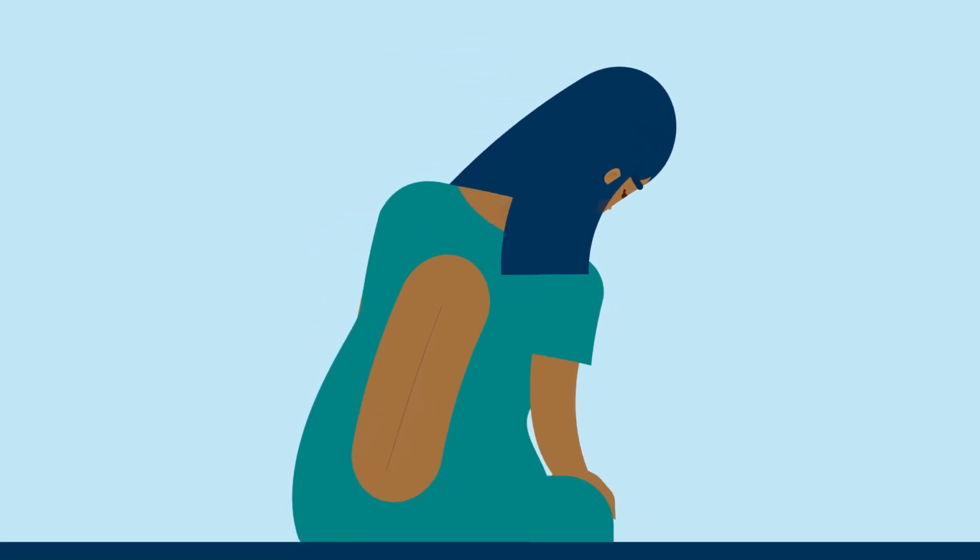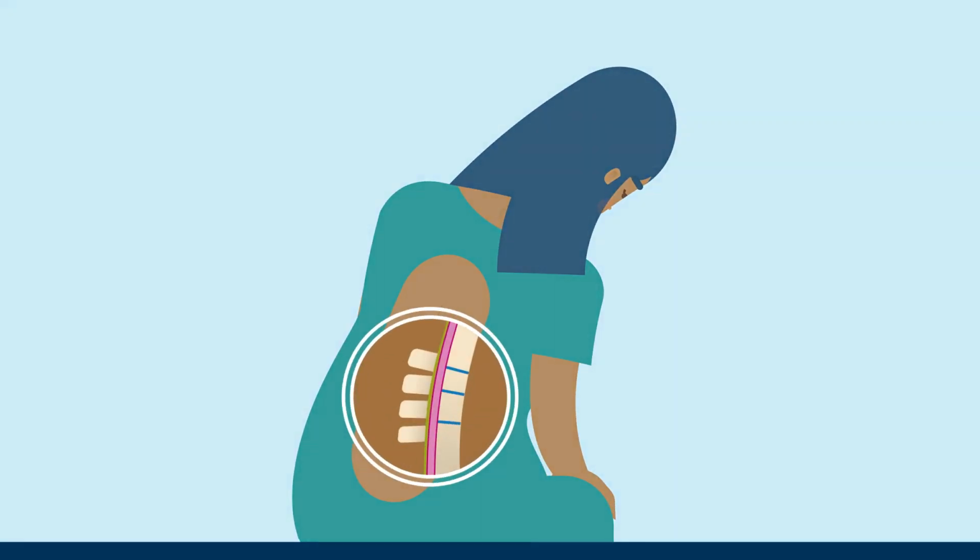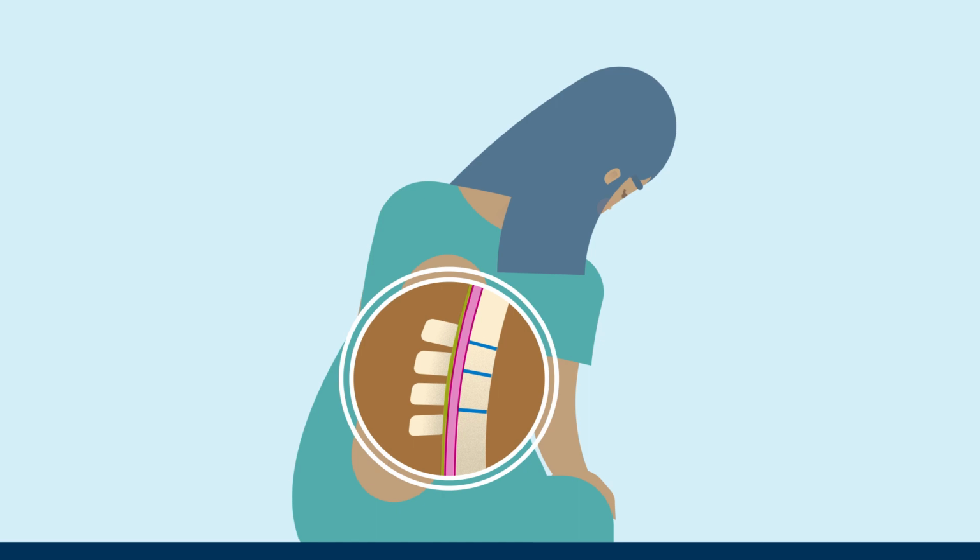You'll be asked either to lie on your side with your knees tucked into your chest or to sit upright and lean forward. This opens up the space between the bones in your spine.